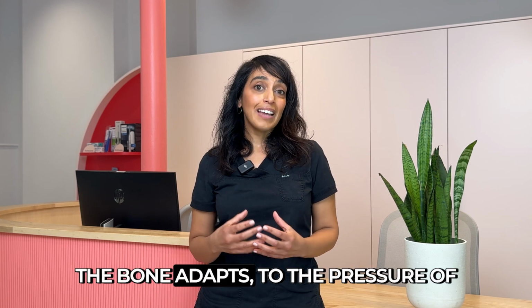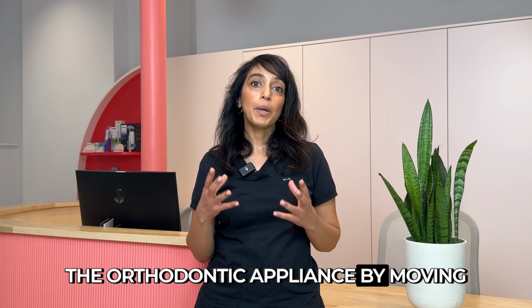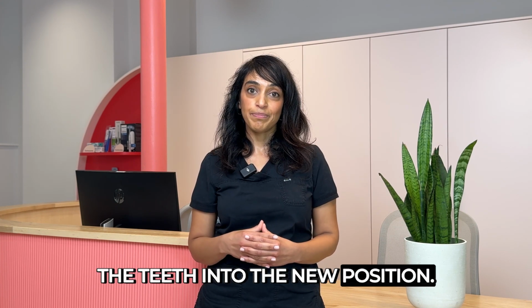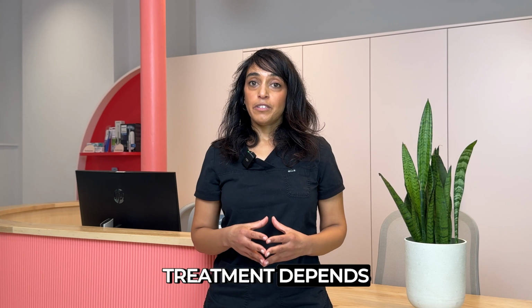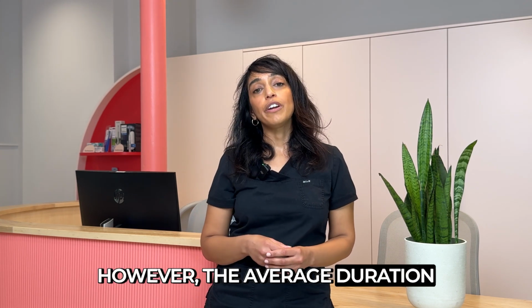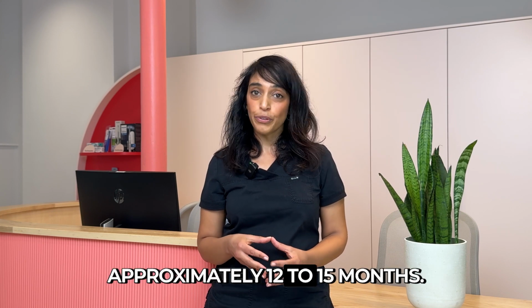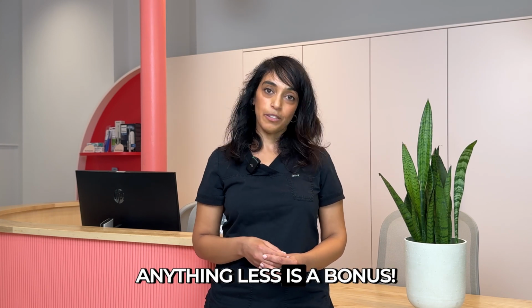The bone adapts to the pressure of the orthodontic appliance by moving the teeth into the new position. The length of orthodontic treatment depends on the complexity of your bite. However, the average duration of treatment with metal braces is approximately 12 to 15 months. Anything less is a bonus.